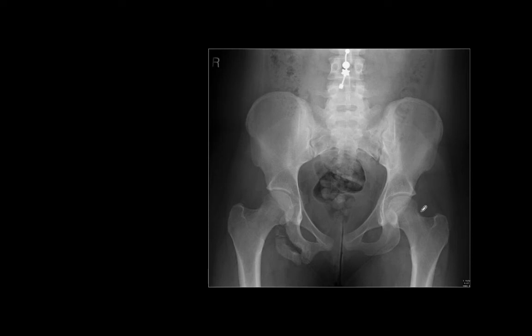Now here's another example of a fracture pattern that can have some complications to it. And actually, when we talk about avulsions in general, complications include things like non-union, where the piece of bone just fails to reattach to the parent bone. And that's the case in this particular diagnosis. But at this location, the fracture that does not unite can hypertrophy and get larger. And these are called rider's bone.